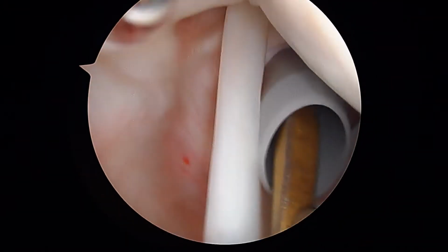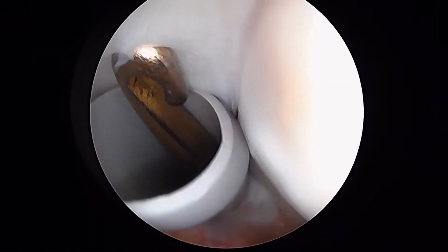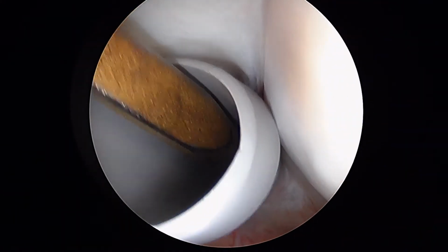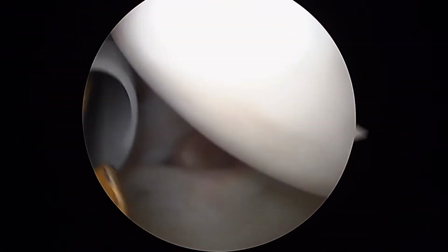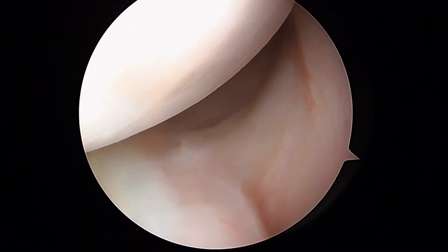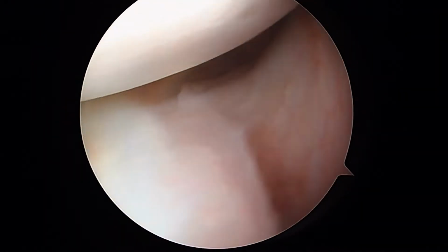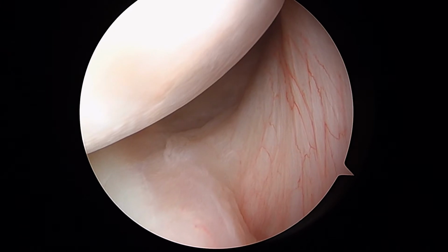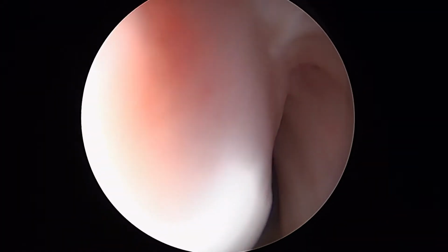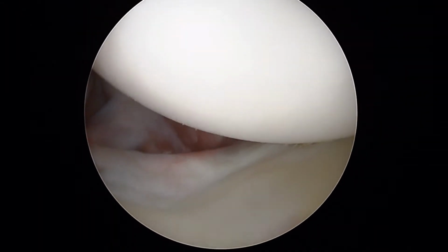As we look up at the rotator cuff tendon, the rotator cuff looks great. This is the rotator cuff up here. No signs of any trouble here. There usually isn't if we're dealing with a SLAP lesion like that. This is the back of your shoulder. There's the posterior band of the inferior glenohumeral ligament down there, that little fold right there in the middle of the screen. We can look at the capsular insertion into the humeral head. That looks great. No signs of any articular cartilage problems.